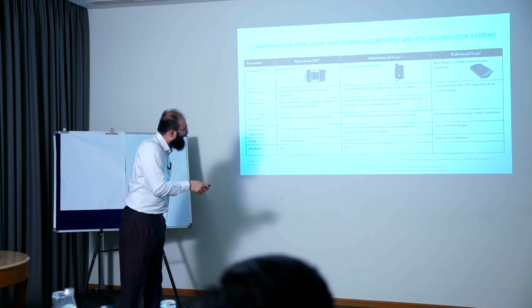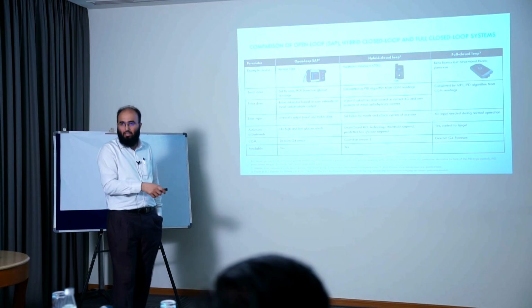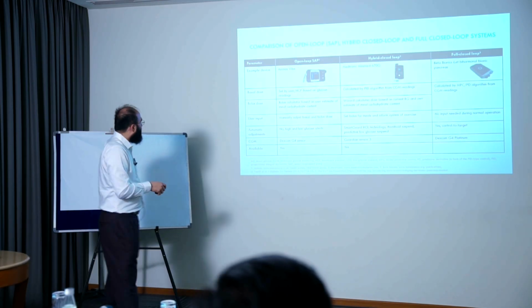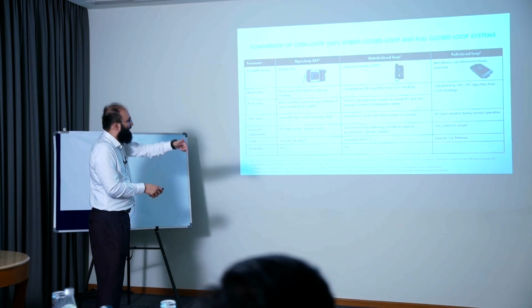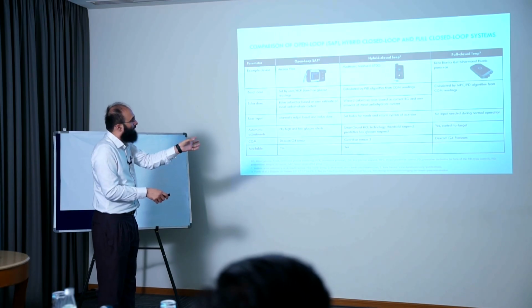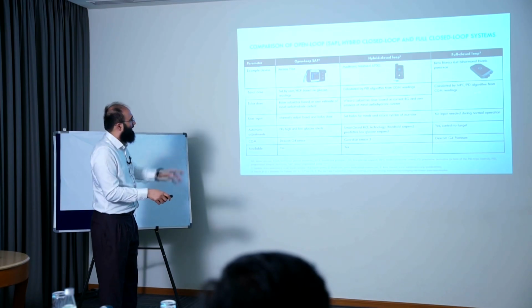Here the PID algorithm calculates from the CGM reading in HCL. Bolus dose: bolus calculator based on user estimate of meal carbohydrate content. I'm taking 100 grams, I input it. Wizard calculates dose based on current blood glucose and user estimate of meal carbohydrate content. So that is the bolus wizard, and here it is automatically taken care of.